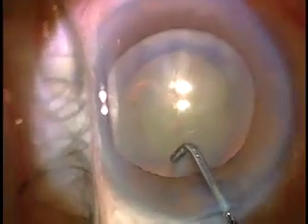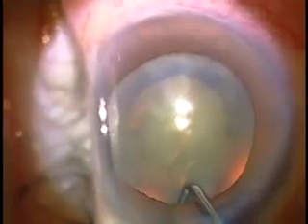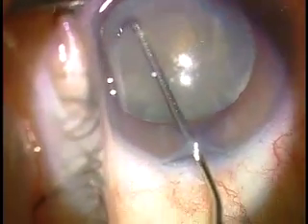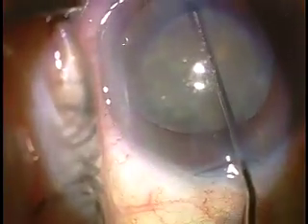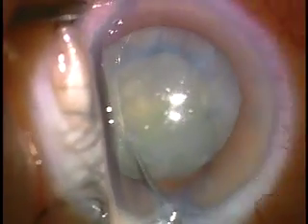This is a 26-gauge cannula. I go right under the cortex, under the capsule to separate cortex from capsule, and then use that tip to pull the nucleus away from the equator and rotate so that I can spin the nucleus at least 180 degrees, sometimes 360 degrees, to make sure that all attachments to the cortex are severed.